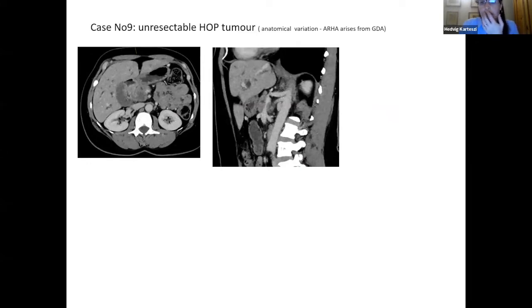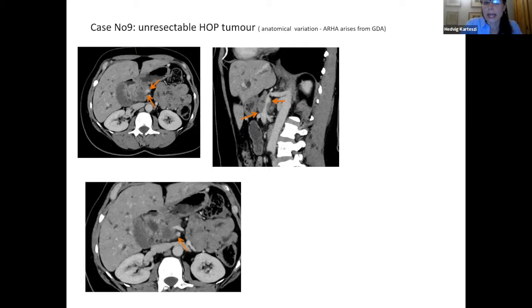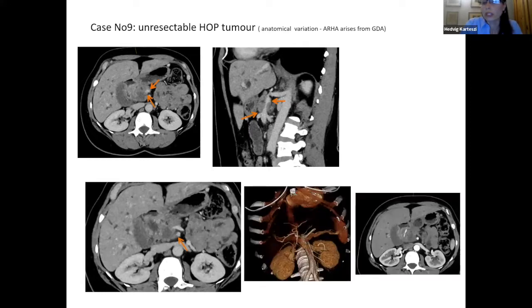This was a shocking diagnosis in this 35-year-old patient who was very fit. But you can clearly see that with appropriate reconstructions, we can demonstrate a long section encasement of the SMV with near occlusion of the lumen to the level of the tributaries, and the tumor was also in contact with the SMA. Long section contact between the tumor and the replaced right hepatic artery is also demonstrated on this staging CT scan. At this stage of investigations, we hoped that this tumor would have a very good response to chemotherapy and would potentially be operable.